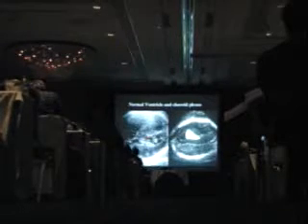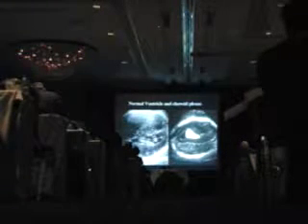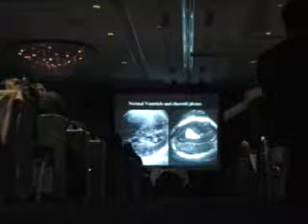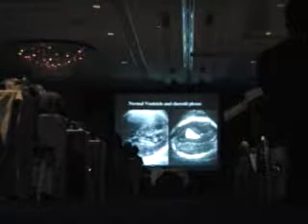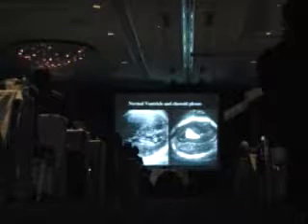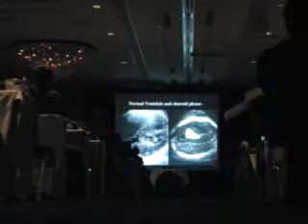You can actually angle a little bit tangentially and see the entire choroid sort of spread out. Of course, that's not a good place to measure it, but it's a good place to observe it, perhaps, if you want. And sometimes the upper ventricle can only be observed this way because of the shadowing that you get from the skull coming in the front. So you have to come in through some sort of a suture in order to demonstrate that lateral ventricle. So a lot of times we measure the one at the bottom because we see it better, and then the one on top we sort of angle to get in there.